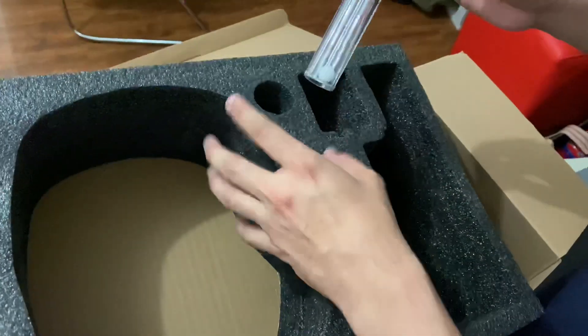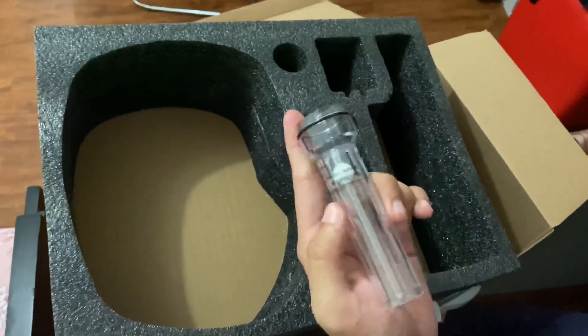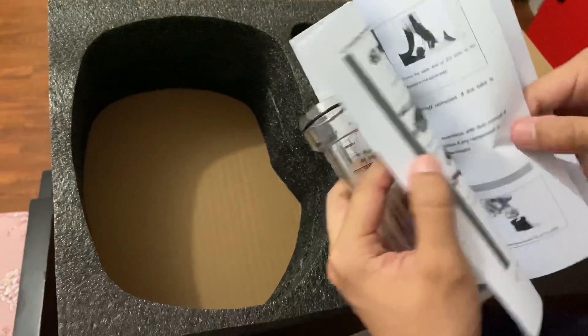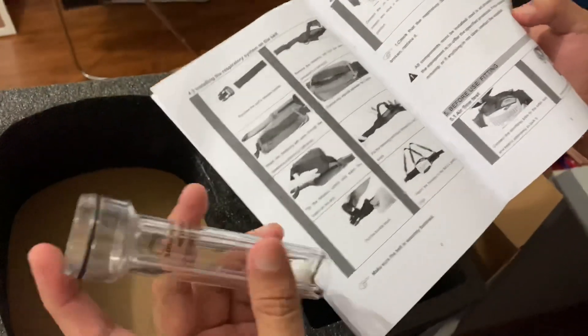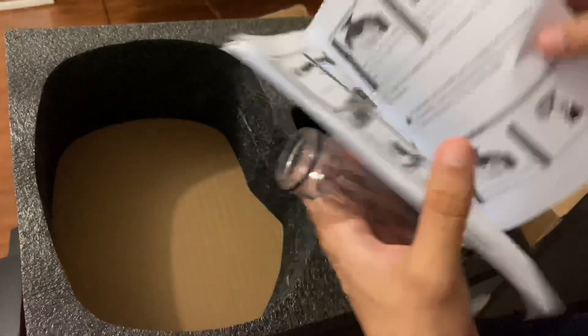So, it has one unit here. And this one is an airflow meter. I think you can use this — let me read that — for airflow test, wherein you connect this to the respirator unit. I guess that's all of what's inside the box.